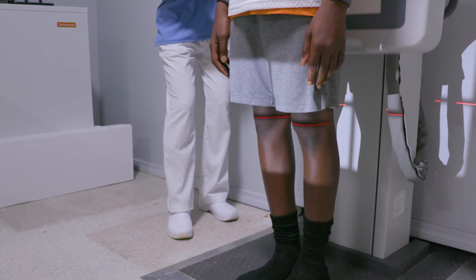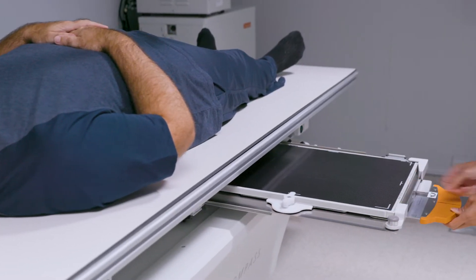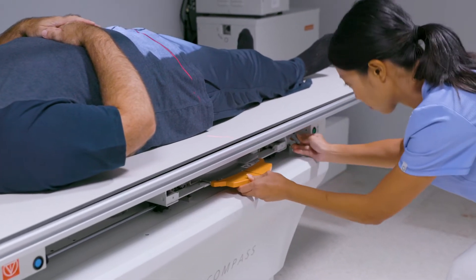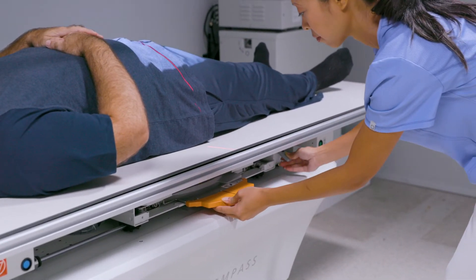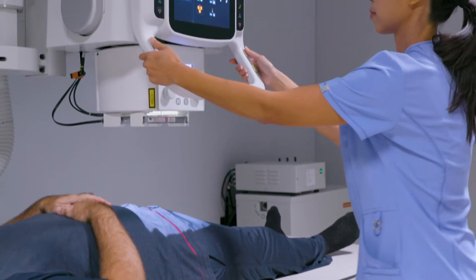Like a lot of facilities today, we wanted to step up to the benefits of a full x-ray suite with advanced features. We were looking for versatility, functionality, and quality that we could rely on into the future and that would grow as our facility expanded. So we chose the CareStream DRX Compass X-Ray System.